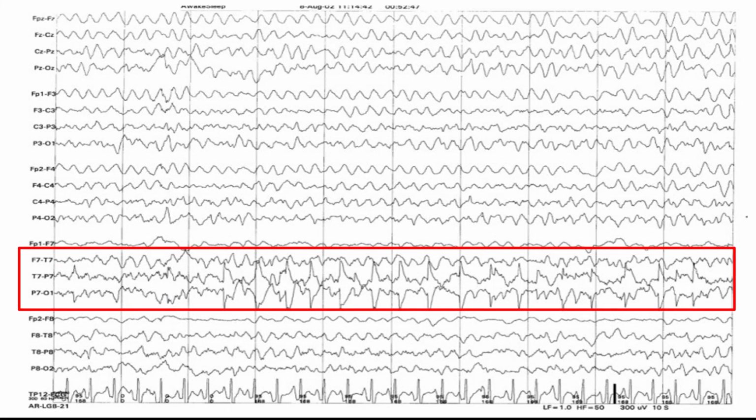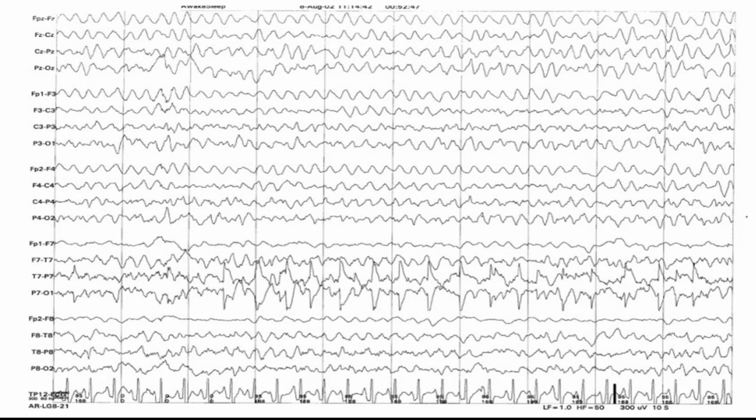This commonly happens as you are recording, and sometimes it's not clear if it's artifact or the actual EEG activity. The reading neurologist would not be able to confidently confirm if it's an EEG abnormality if it's recorded from a poor impedance. So this is why frequent impedance checks are so important with long-term patients that keep electrodes on for an extended amount of time.